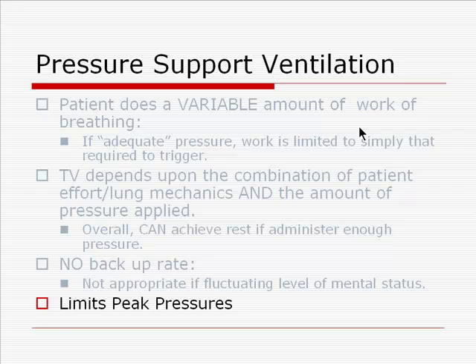The main benefit of pressure support ventilation is that it by definition limits peak pressures. Theoretically, pressure support ventilation may also be more comfortable for some patients.